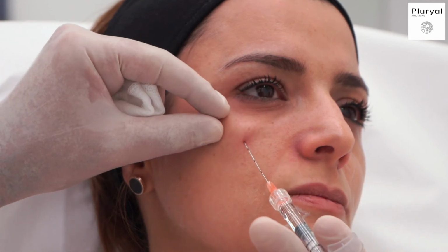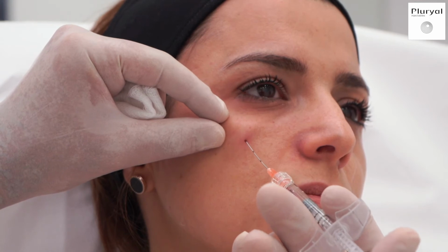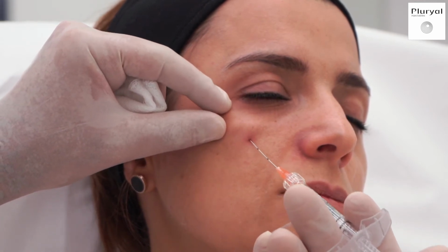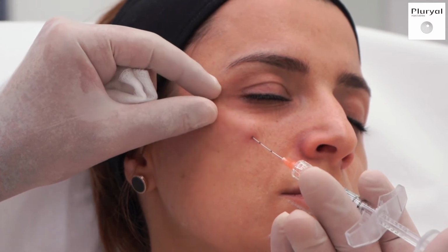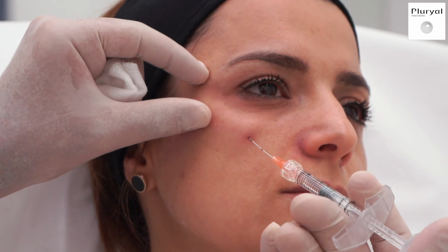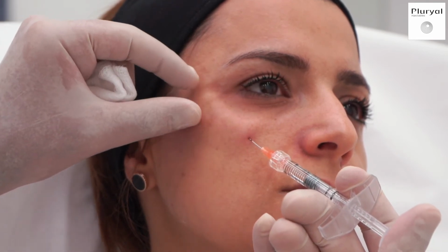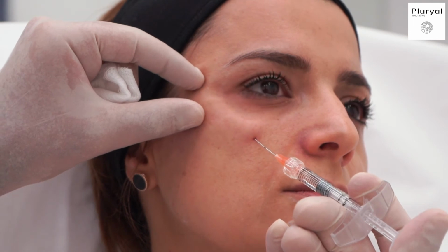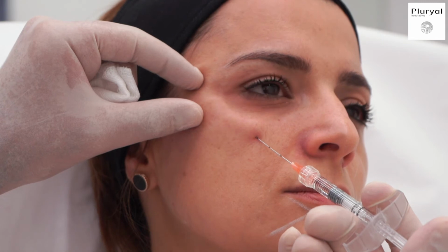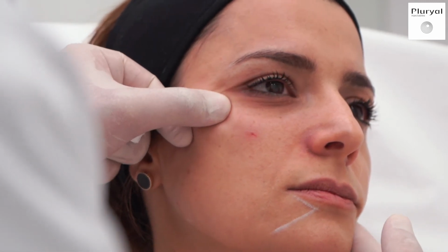So to fill the lateral sulcus. Then I massage it.